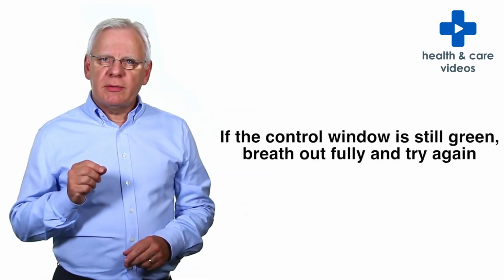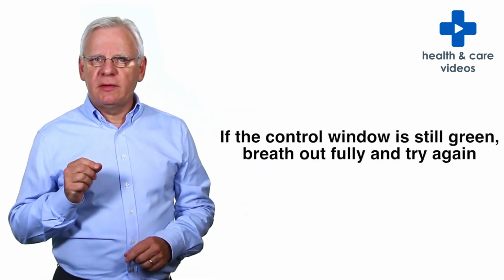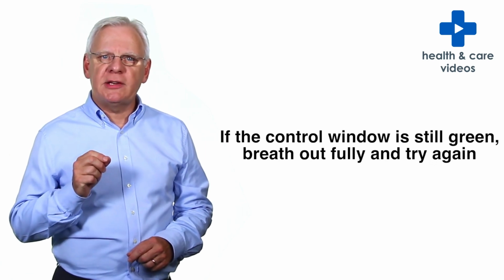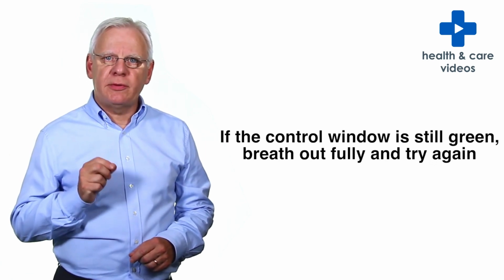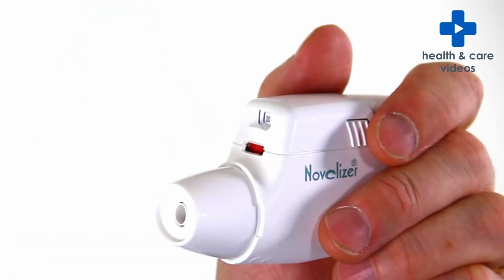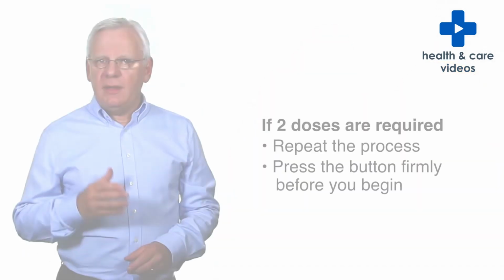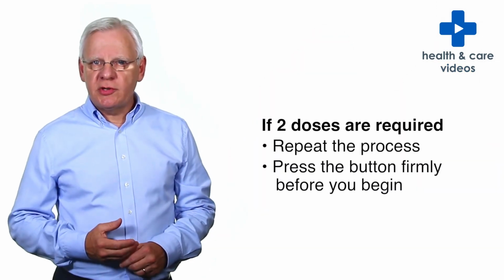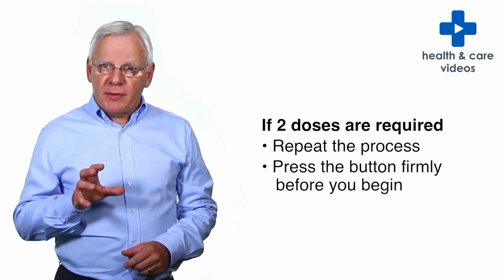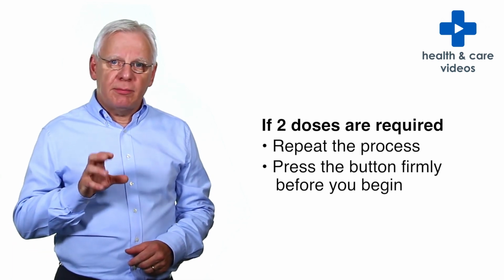If the control window is still green, you've not taken the full dose of medicine, and you need to breathe out before inhaling strongly and deeply through the mouthpiece again. The control window will turn red when you've inhaled the full dose of medicine. If your doctor has told you to take 2 doses of medication, repeat the process, remembering to press the button firmly before you begin.